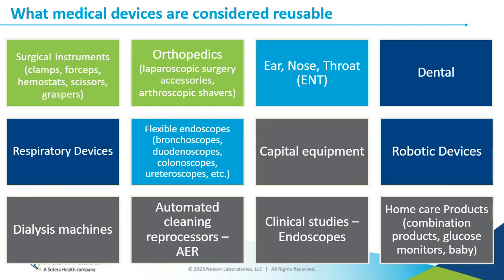Now, if we look at what sector of the industry is reusable, it's not a huge portion, but it is starting to become a huge portion of the industry. We often are linked with single-use devices, you use, throw away. Now we're starting to see those single-use devices migrate towards reusable and being asked, can these be reused? And so we're seeing the med device industry trying to make devices that are single-use now reusable. So we have a huge sector that we're working with.